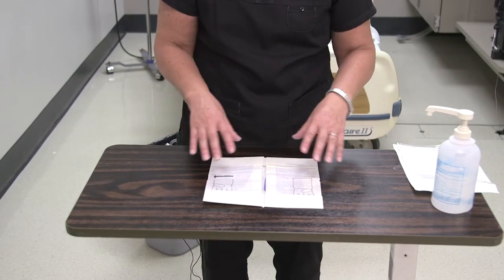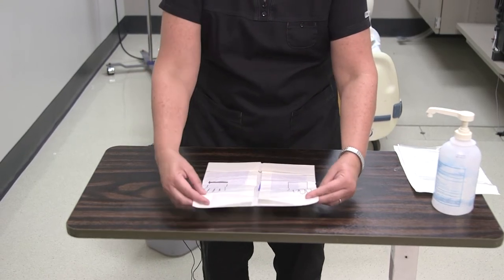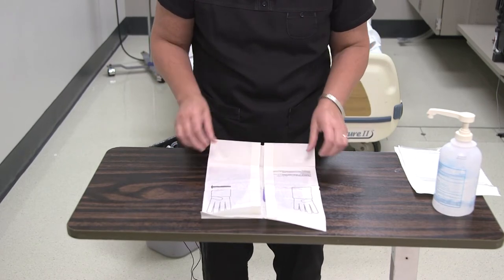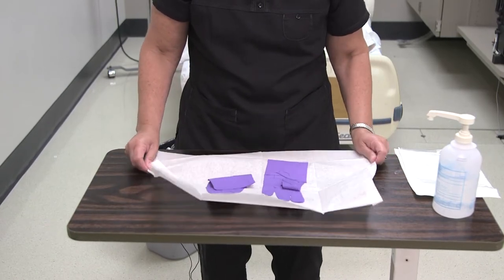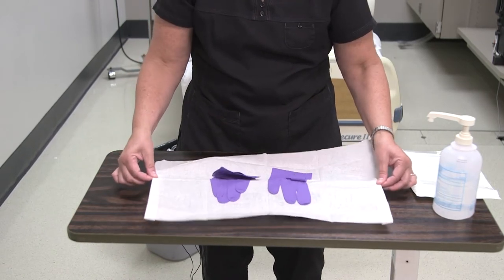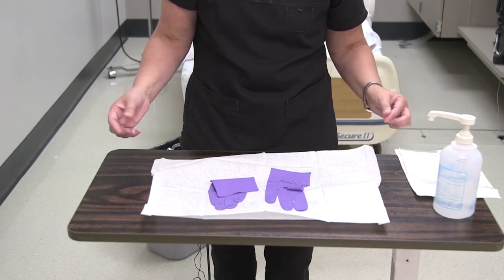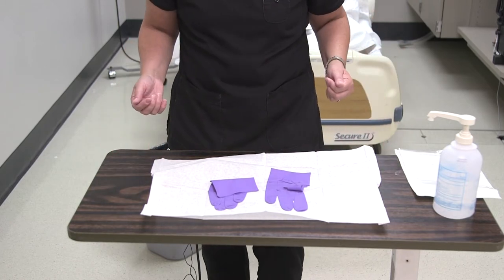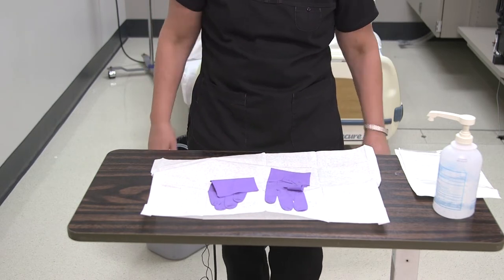When you open a sterile package, no matter what it is, you always want to open it up towards that way, away from you. And then you can do the bottom here on this one. And then again, you're going to open this up just kind of like a lapel. Give it a little tug, just to make sure that it's open so it doesn't fold back up on you. So now we have basically a sterile field. You don't want to touch anything inside the 1-inch border on the outside of this. And you want to avoid reaching over your sterile field as well, or putting your hands below the sterile field.